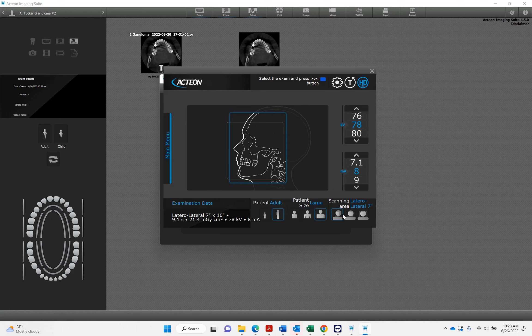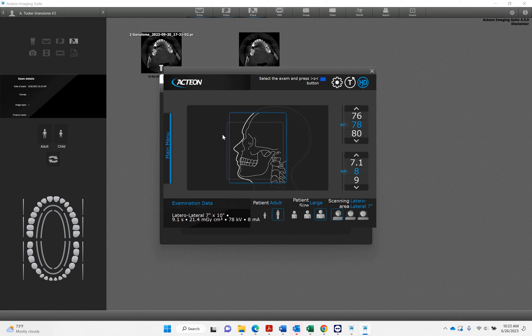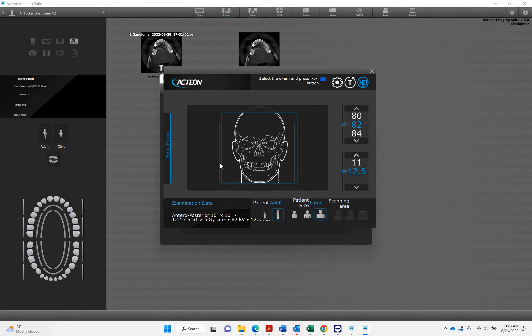I'm always going to default to large — you can determine what size you're taking. You've got CEPH: your traditional lateral CEPH versus your anterior and posterior.